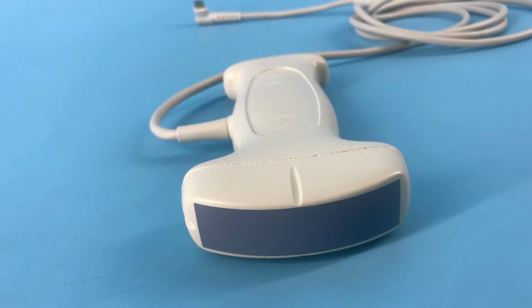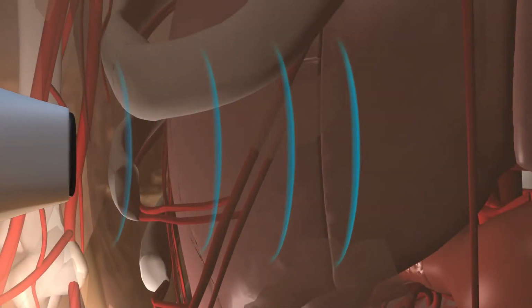This device has many applications like producing sound from electric signals, getting sound and converting it to electric signals. This is the basics of the working of sonography. The sonography device has a transducer which we can see here. This transducer directs ultrasound waves into the body. They pass right through the skin and into the internal anatomy.